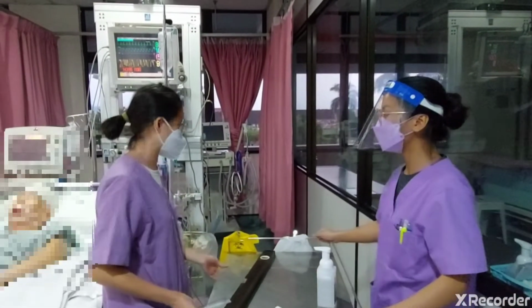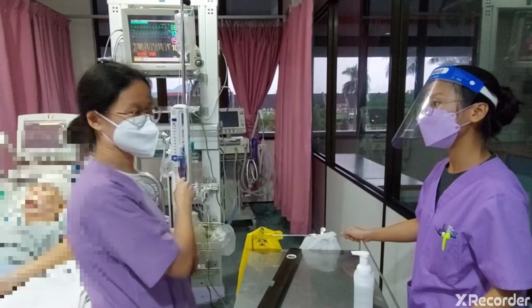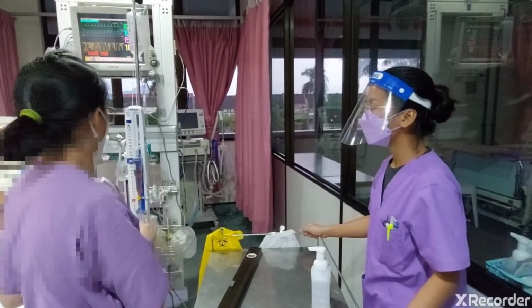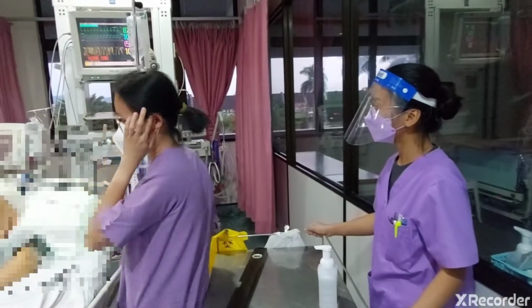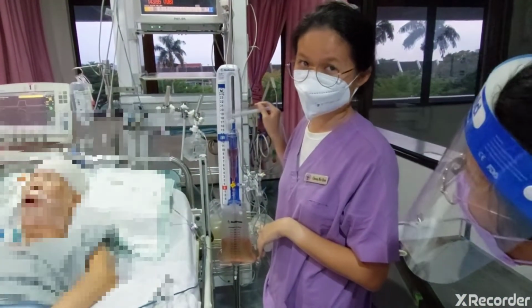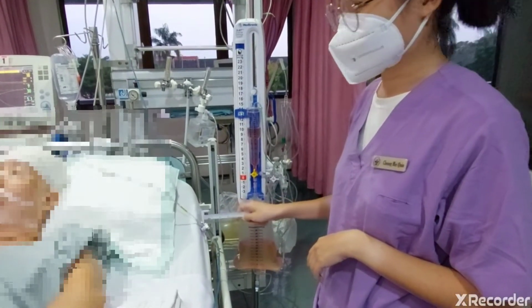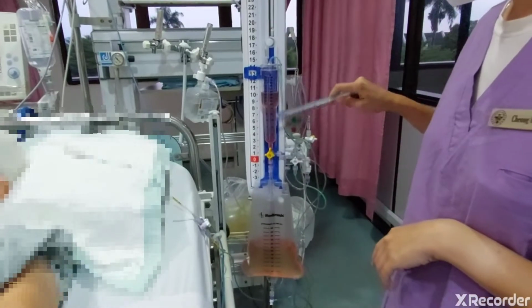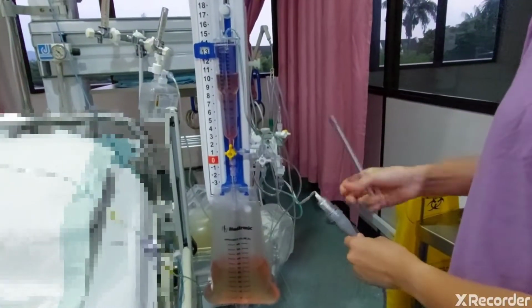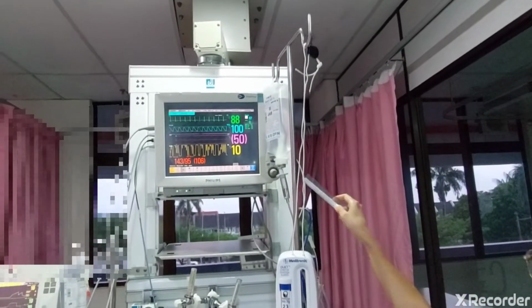Today I would like to show you how to do zeroing of the EVD and how to measure the ICP. Before that we need to know this system. This is the external ventricular drainage system. It consists of the ventricular catheter, this EVD system, and this cable that connects to the monitor to measure the ICP.